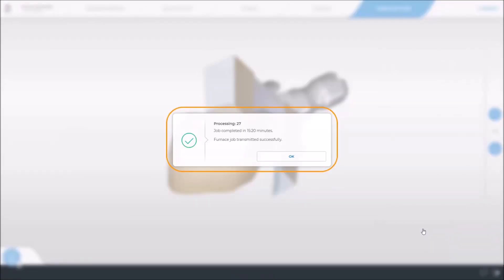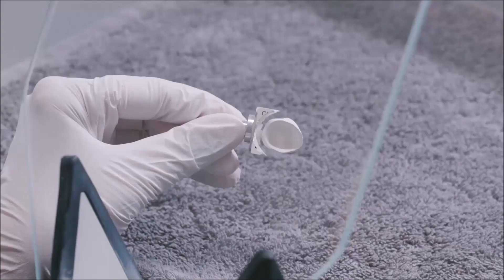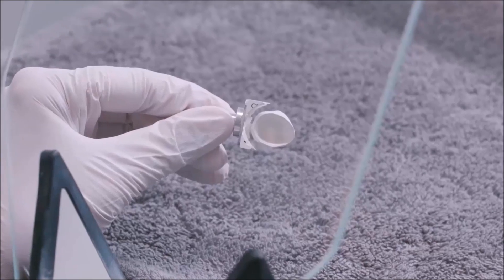At the end of the milling process, a message is displayed to inform the user about the completion and that a firing order matching the restoration has been transmitted to CEREC Speedfire. We confirm with OK and switch to the CEREC Speedfire operating panel, which displays the sintering job at the very top of the received orders overview.